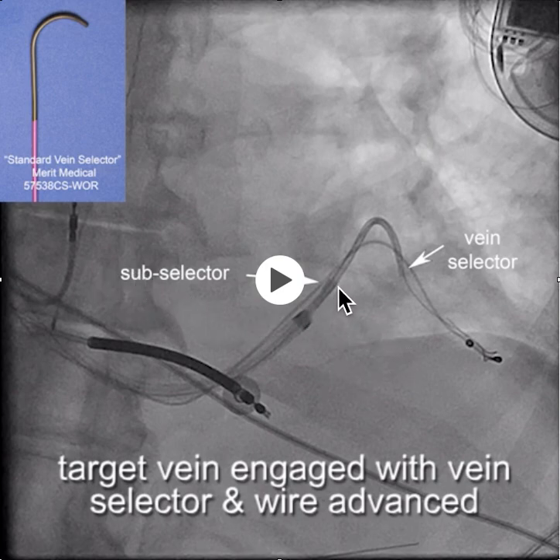We first have the sheath here, the vein selector back here, and then we engage the vein with a standard shape vein selector, because it seems to fit that vein particularly well.